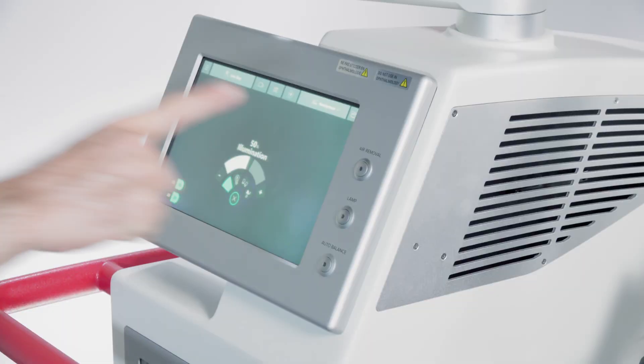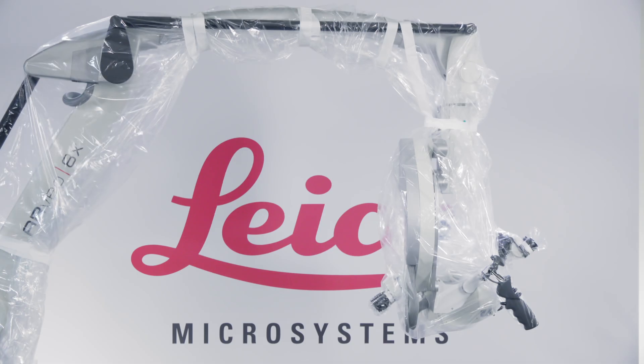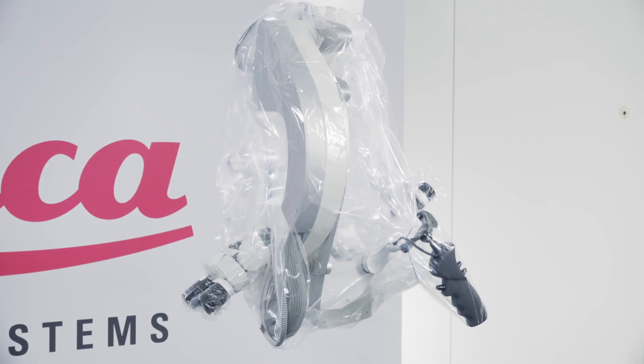The RVO-8X is equipped with an integrated air removal system. Press the button next to the user interface to activate the pump, which extracts excess air from under the drape.